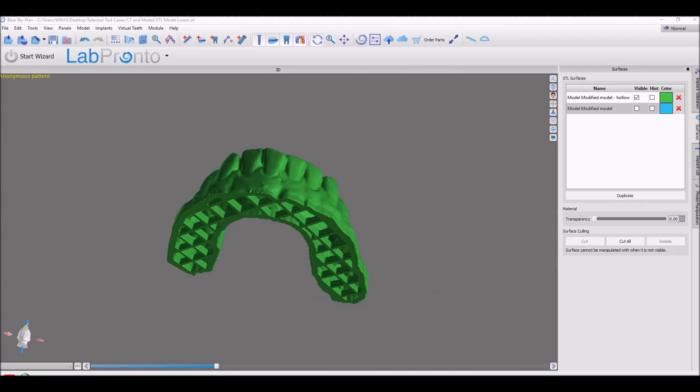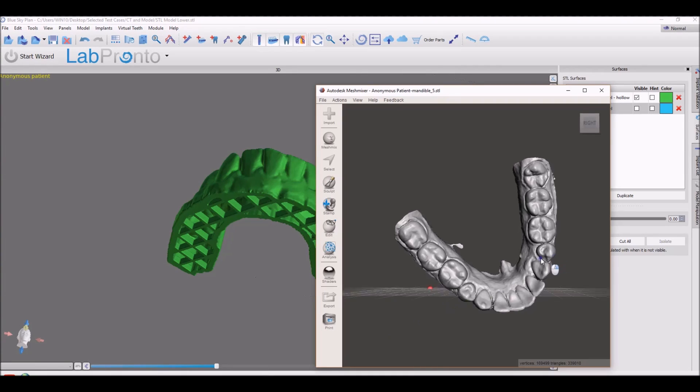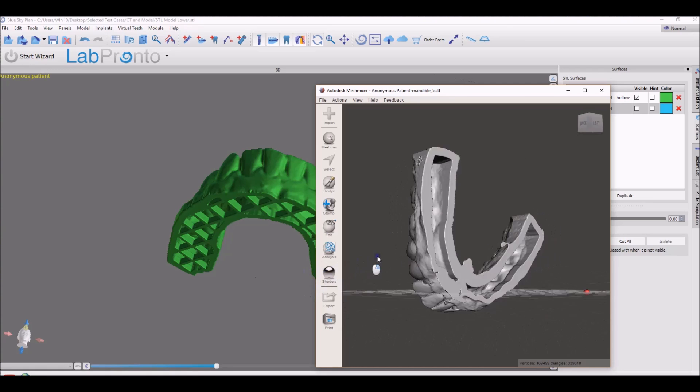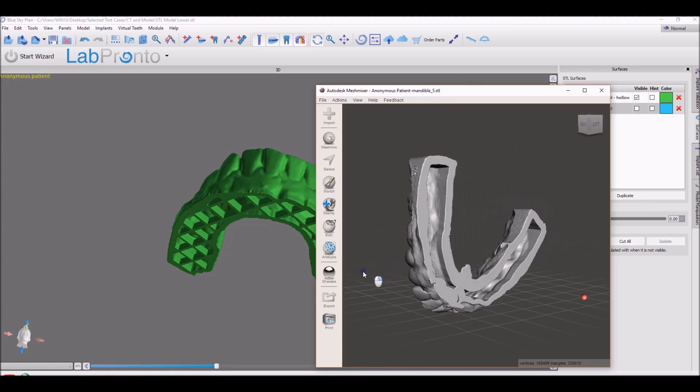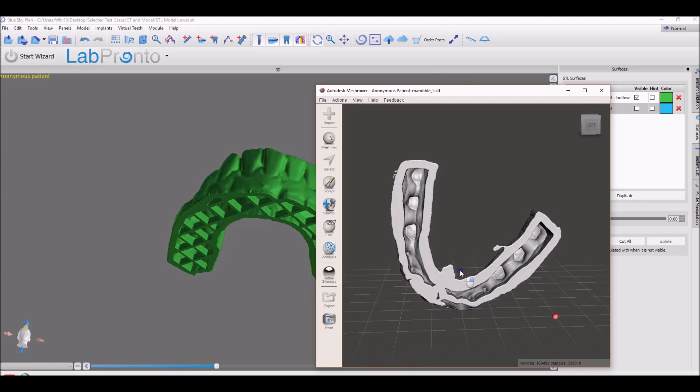In the ortho module, models are now exported hollow, again saving printing time and printing material. The option exists in options if you want to print out the model with the base grid as we see in the surgical guide module. That can be done in ortho as well.